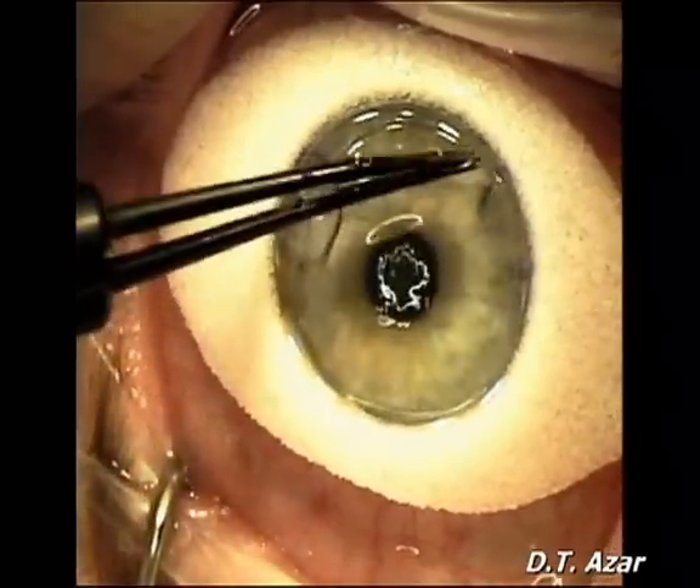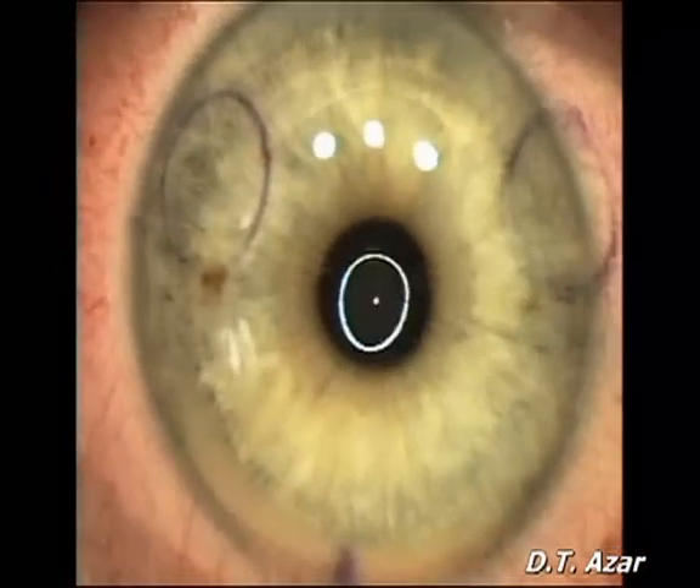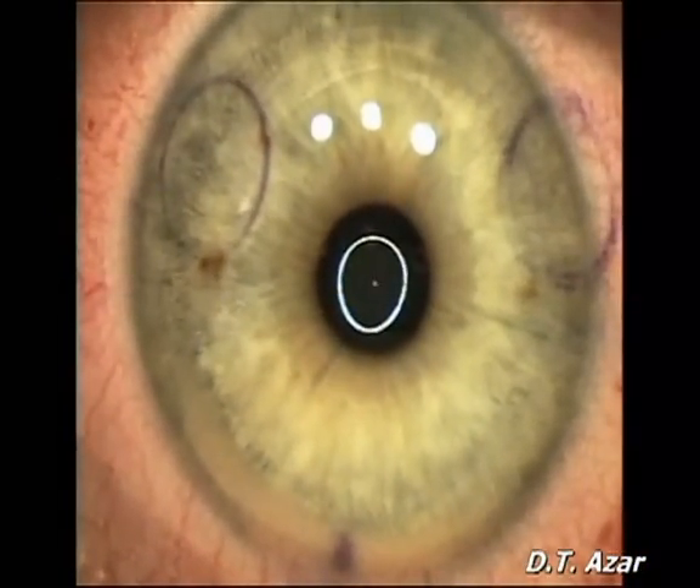The flap is repositioned and centered using the gentian violet markers as guidelines. A cellulose sponge is used to sweep the flap and remove any interface fluid.